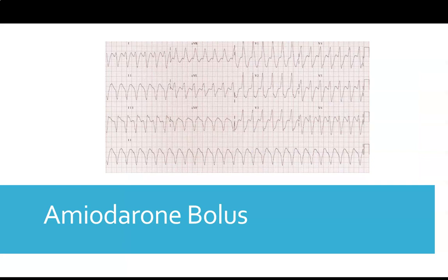All right, so let's look at another scenario in general mode again. We're going to pretend that we have a patient who presents in ventricular tachycardia, but they are stable. You make the decision that you're going to manage this patient with amiodarone. You're going to give this patient 150 of amio. And the question I want to ask you is, if this patient is in ventricular tachycardia, you are giving them amiodarone to get them out of ventricular tachycardia, are you giving the patient a bolus or an infusion of amiodarone? I hope everybody said a bolus of amiodarone.